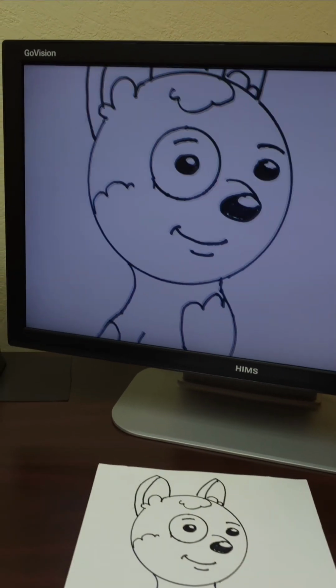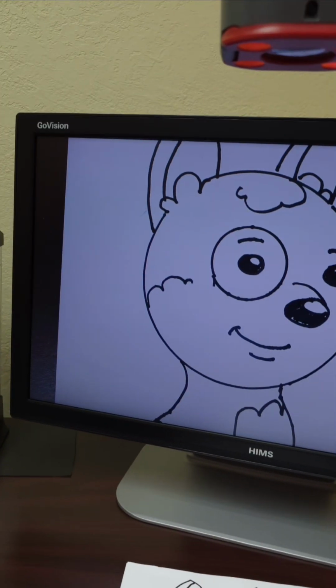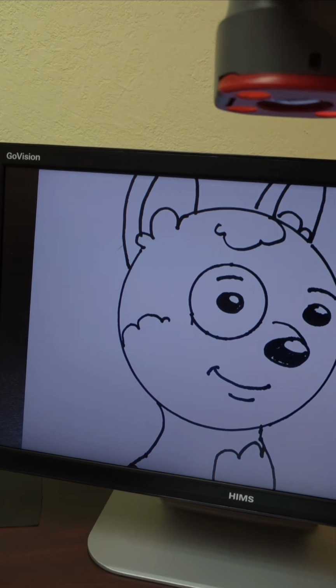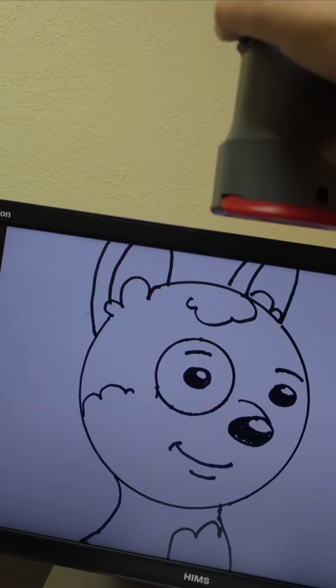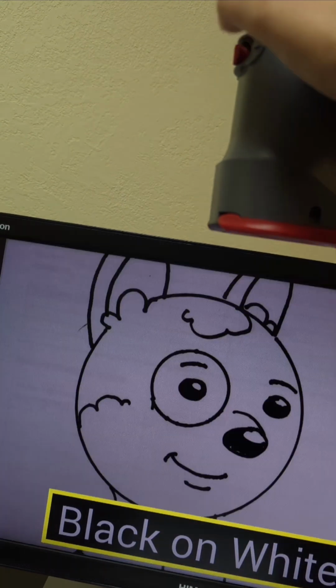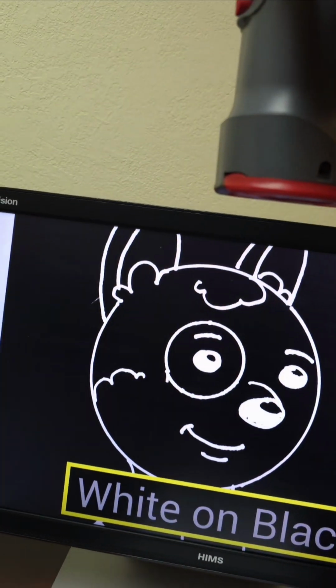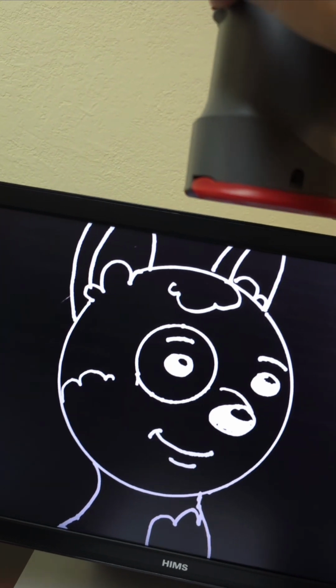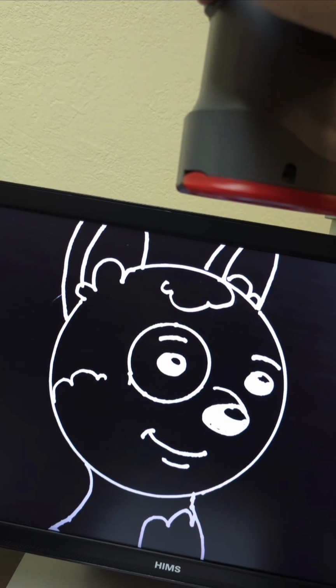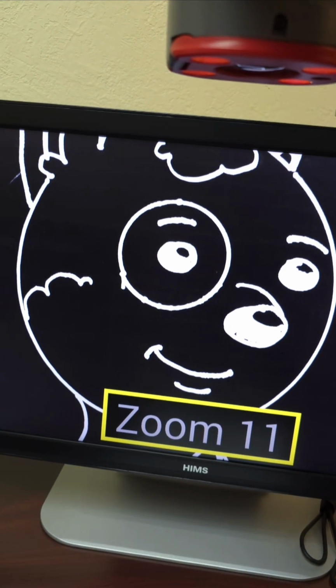So how I would use this, I'm going to go back up here to my camera because this is just how I'm used to doing it. If I push the red button one time here and another time, now I got it to my favorite setting. If I push this little red button forward, it's going to zoom in.